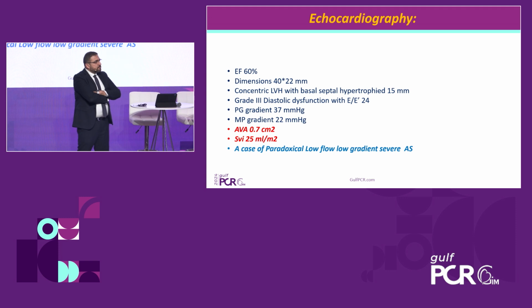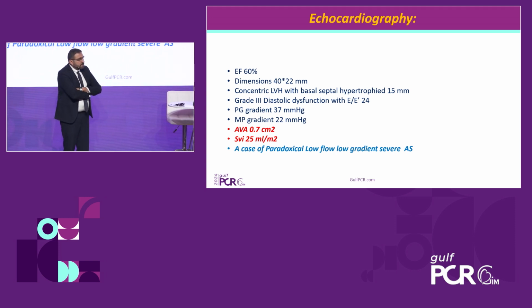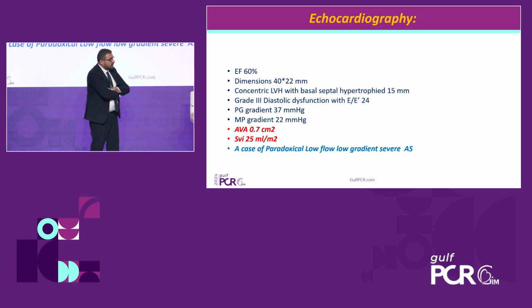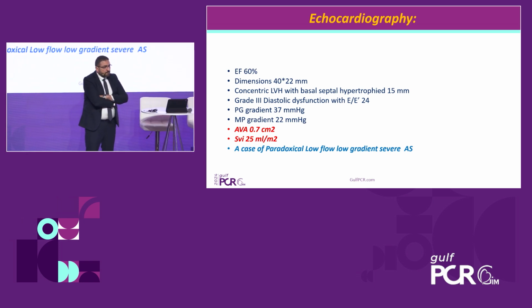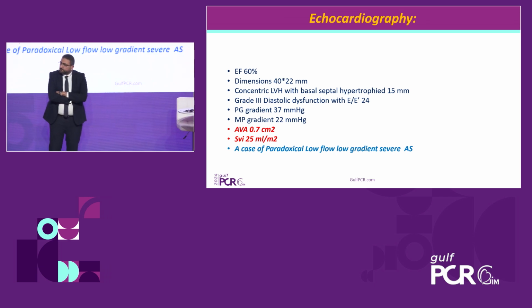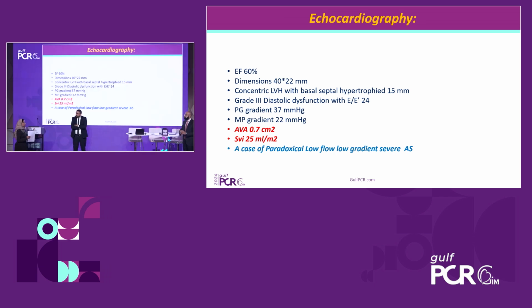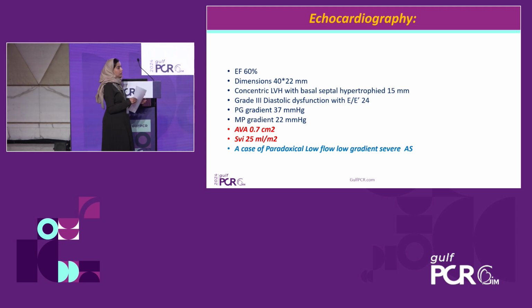May I stop at that point and discuss with the panel: obese patients with that profile, that age, how would you manage such a situation? A nice discussion overall to start with. So it's not the classical severe AS where you can just know that if you fix the valve, you'll improve their symptoms. There are multiple ways of assessing the low flow, as you mentioned.